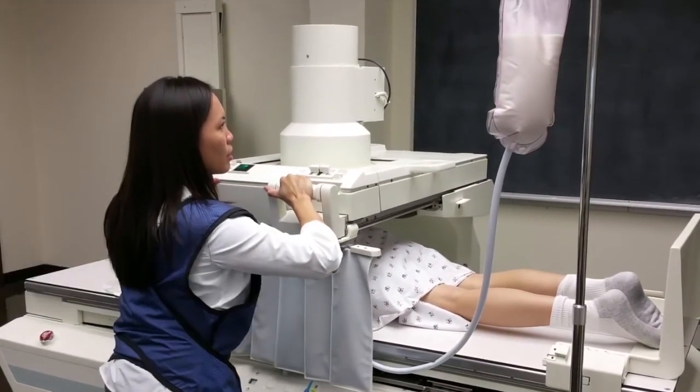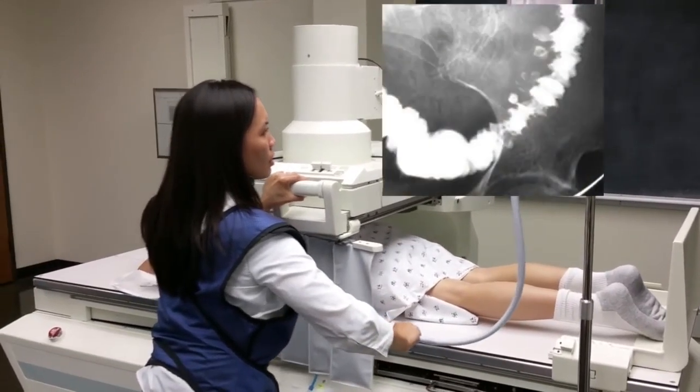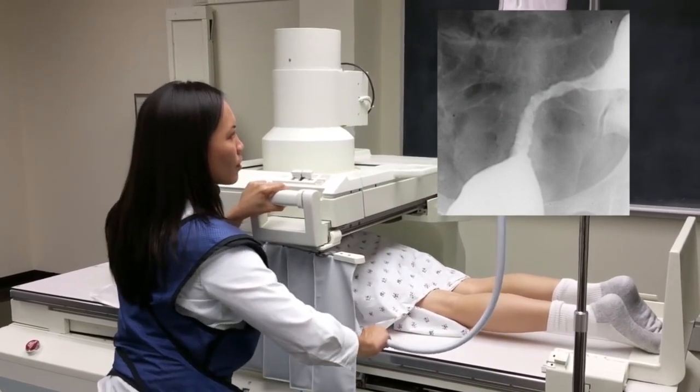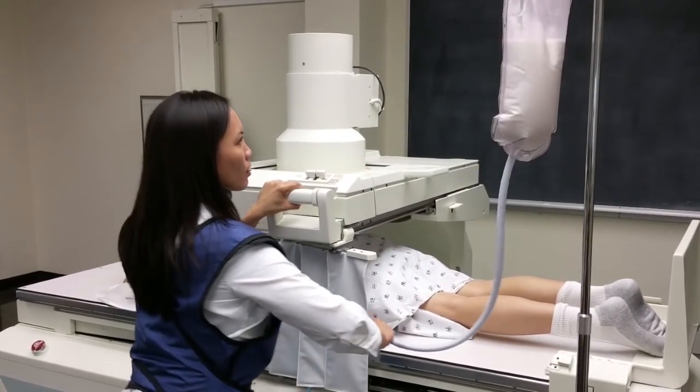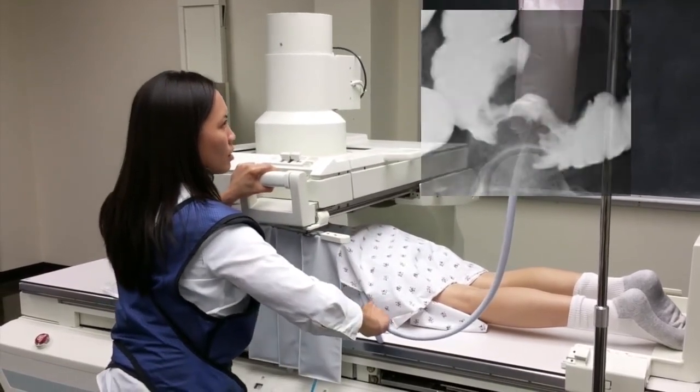Use fluoroscopy intermittently and briefly during this filling phase, but carefully analyze the contour of the colon and look for any abnormalities or defects in the barium pool. If an abnormality is seen while barium is filling the colon, take a spot radiograph.